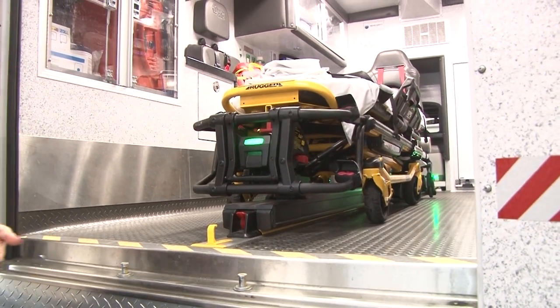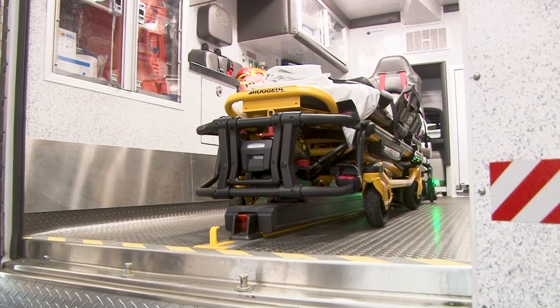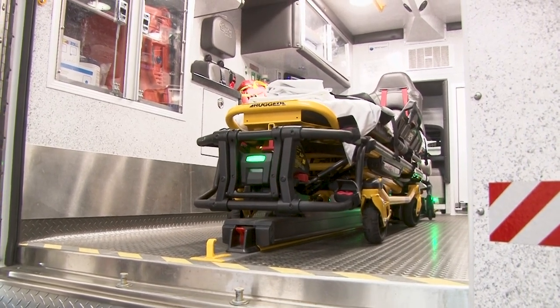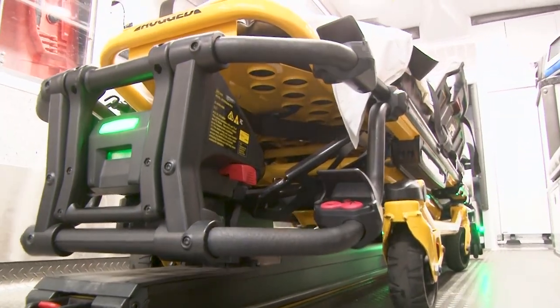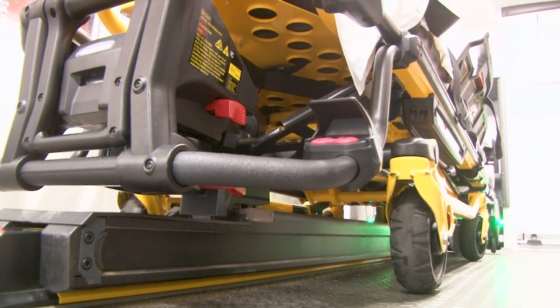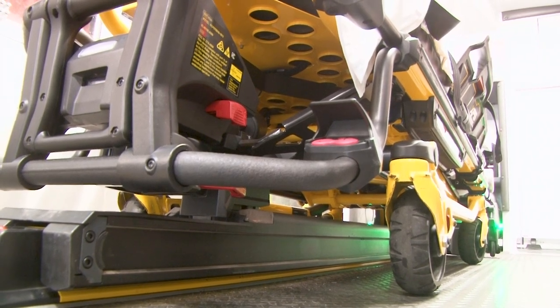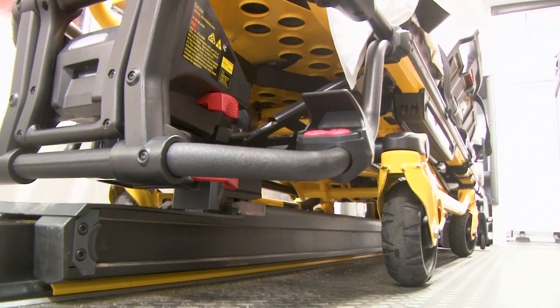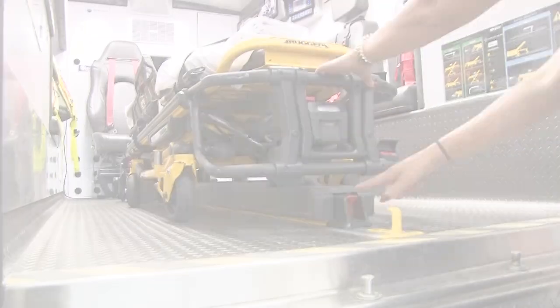So it's a very important piece of equipment for several reasons. Number one, it protects the paramedics and the EMTs who are using the stretcher and prevents any unnecessary back injuries. That's important because if you lose an EMT or a paramedic to a back injury, they're out of work six months to a year, and that can create a problem because of staffing issues. And most importantly, it's safer for the patient, right? The stretcher can hold 750 pounds. It's balanced appropriately. It still has two providers, one in the front, one in the back, and it provides a safer experience for the patient.